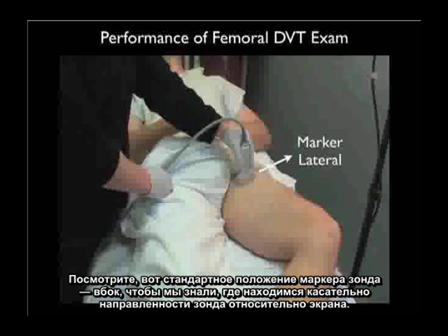Notice here, it's standard to have the marker on the probe going lateral so that we know where we are with regard to the orientation of the probe versus the screen.